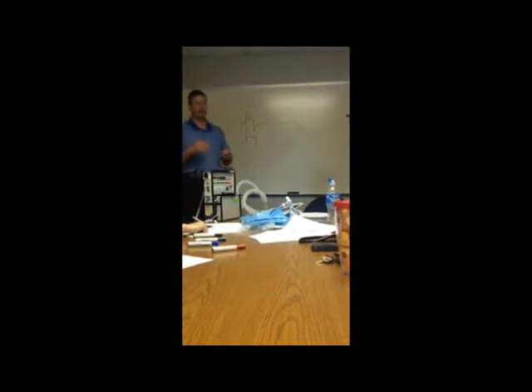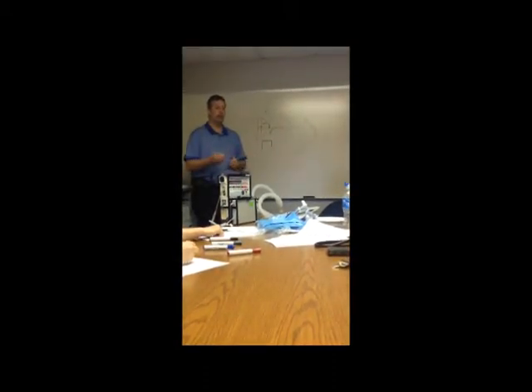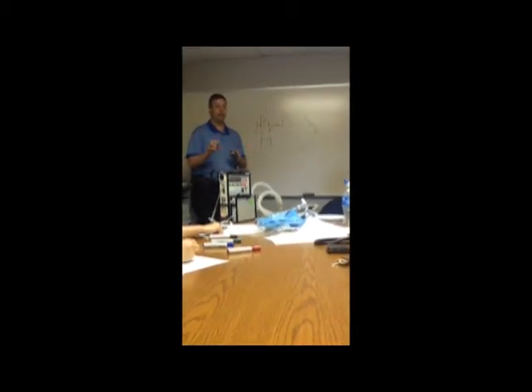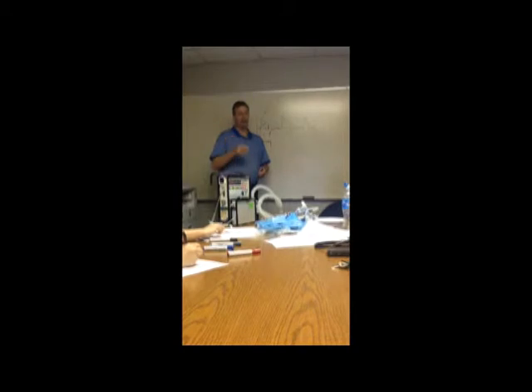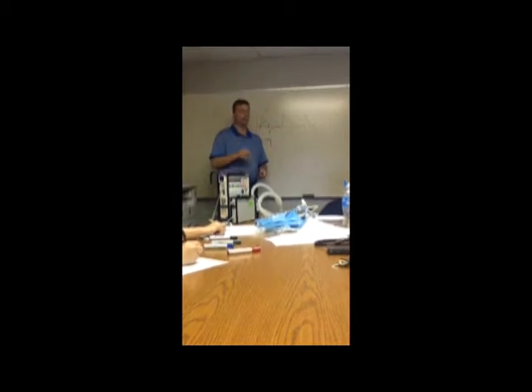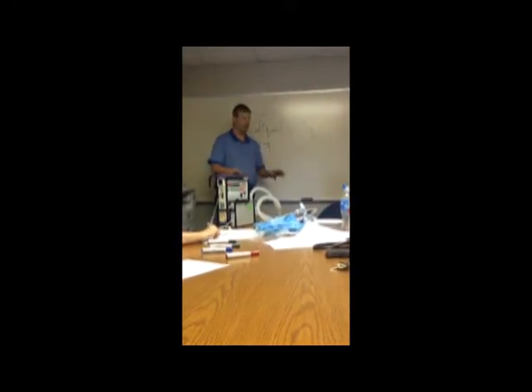All right? And I was asked earlier a couple times about what to go over. And one of the things was, help us set the vent up so it's more like what you would do when we get there. And thinking and talking with some people about that, I think the best thing in that case is if it's not broke, don't fix it. All right, if you have a blood gas and they're comfortable, let them ride. I don't care if you think it's the crappiest settings there are.